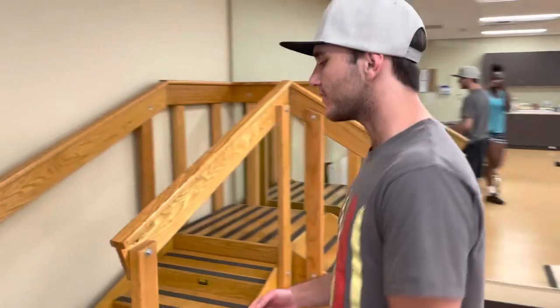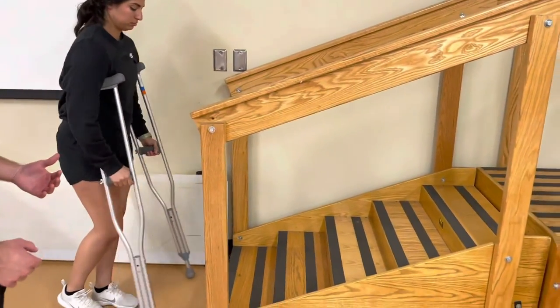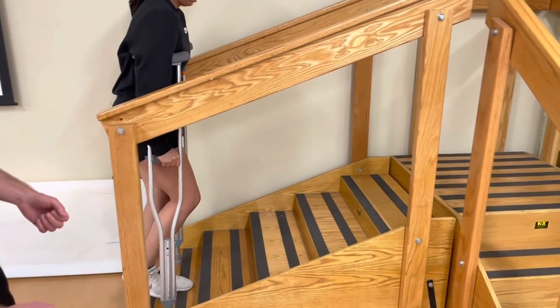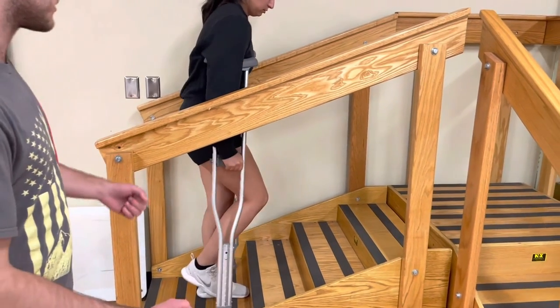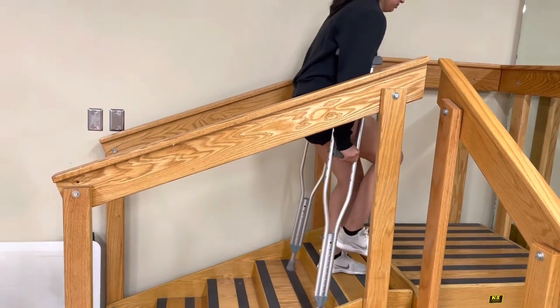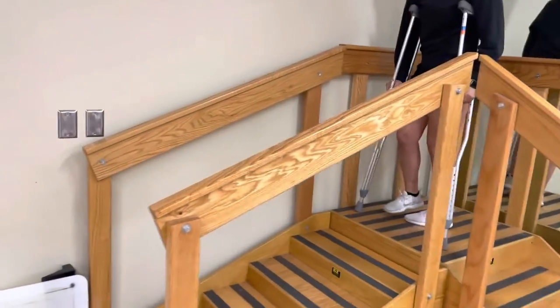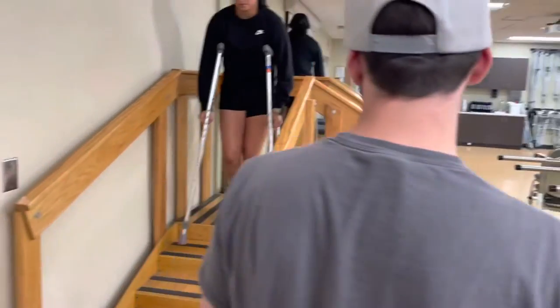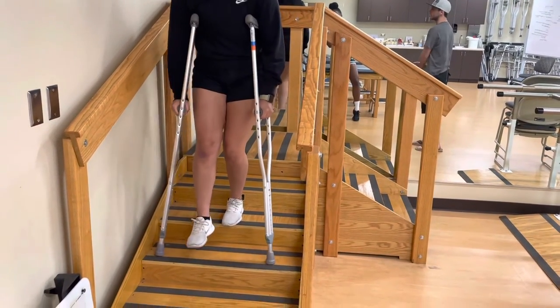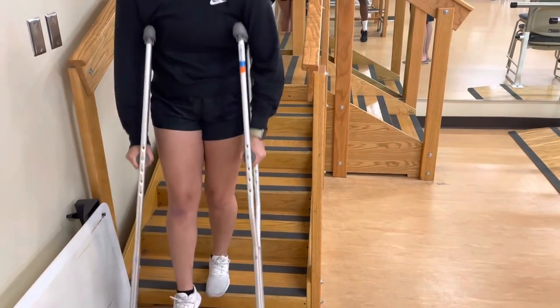If you don't have a railing, go back to using your crutches as normal. Same thing applies: step up with your non-injured foot, bring your crutches up, step up with your non-injured foot, bring the crutches up, and continue until you reach the top. When going back down, bring the crutches down, step down with your foot, crutch down, step down, all the way back down until you reach the bottom.